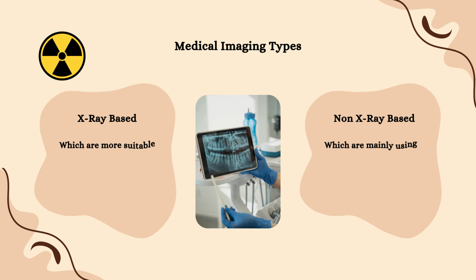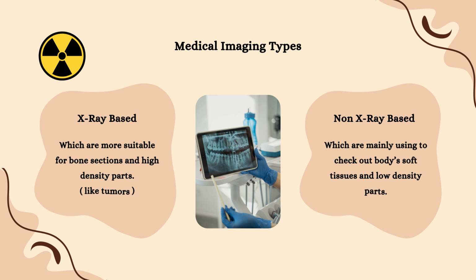All medical imaging methods divide into two main groups. X-ray-based methods, which are more suitable for bone sections and high-density parts like tumors. And non-X-ray based methods, which are mainly used to check the body's soft tissues and low-density parts.